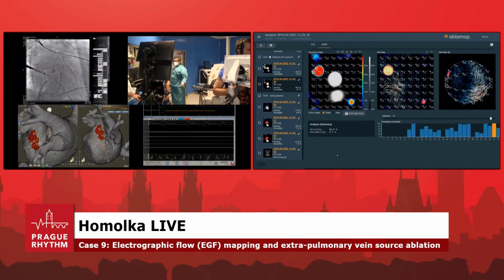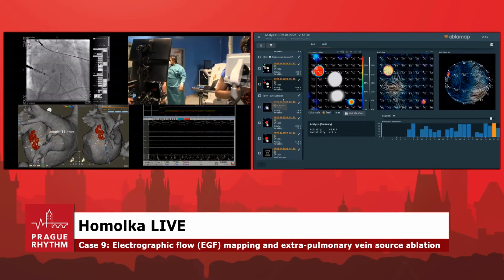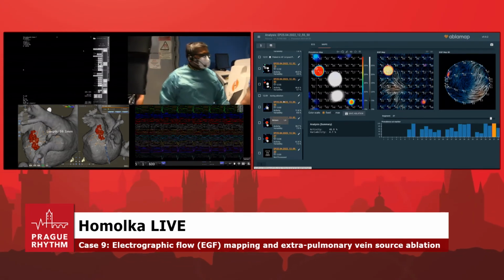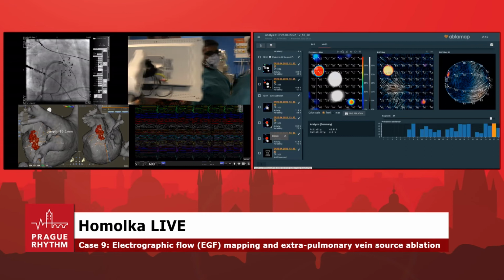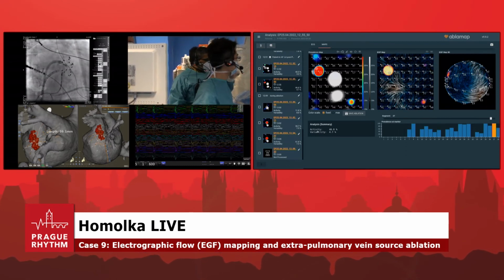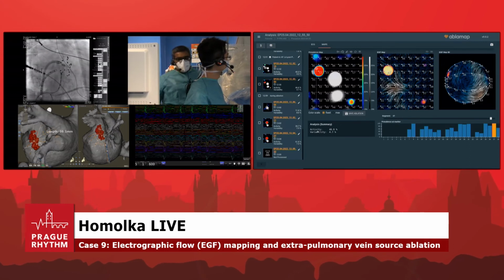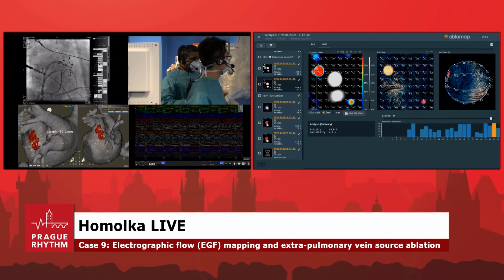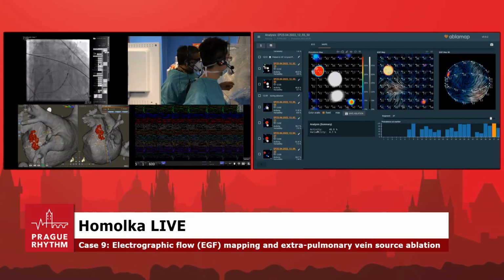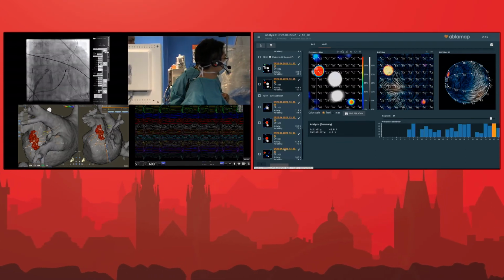I think we recorded it, didn't we? I did a quick cine. Can you show the cine, Stefan? The last cine? Oh, there it is. Okay. If they can see on fluoro, yeah. So we put the Farapulse catheter there, delivered 2 lesions, and now we put the basket back in position. So let's just show the live. This is the live position of the basket.